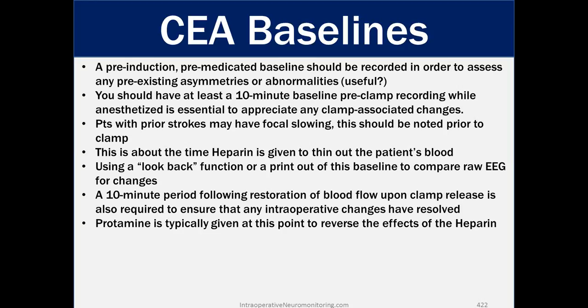Some programs like Cadwell will give you this look-back function you can use as a baseline for your EEGs. Others, like the Eclipse, don't have it as a function, at least the older ones don't. I don't know what their new ones have. So you want to take a screenshot and have that PDF out of the way, or in a small box off to the side at least, so you can reference it, especially if you remember some of those examples I gave. Some of them are pretty subtle changes, and you might miss something because it's happening slowly as it progresses, and to your eye it doesn't look like there's anything significant. But if you had a baseline to look at it against, you would say, okay, that is something happening that has raised the blood pressure, whatever you might do at that point.